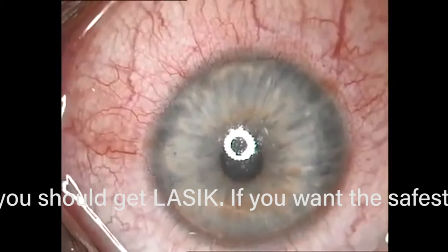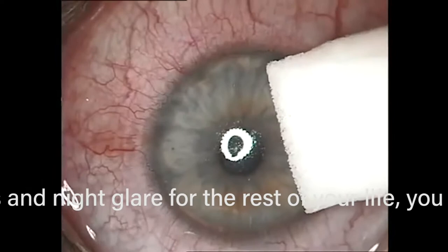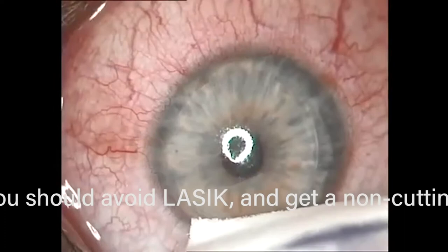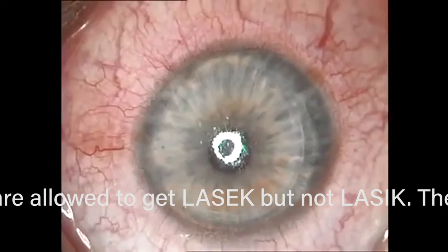With the laser flap you can also cut thinner flaps and treat higher prescriptions because you're not wasting tissue with the flap. The logical conclusion of cutting thinner and thinner flaps is just not cutting the flap at all, which is surface ablation. With a metal blade, the upper limit is around minus eight. With a thin laser flap, it's about minus nine. With a non-cutting approach like surface ablation, the upper limit goes all the way up to minus 19 — you get another hundred microns of tissue to work with.